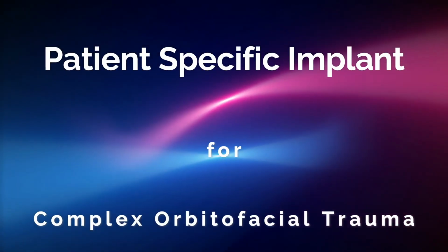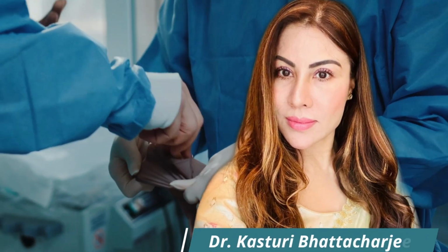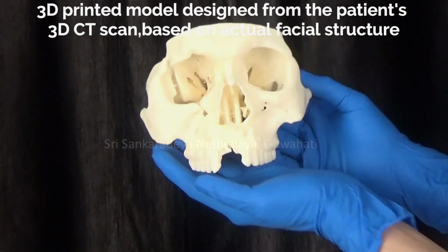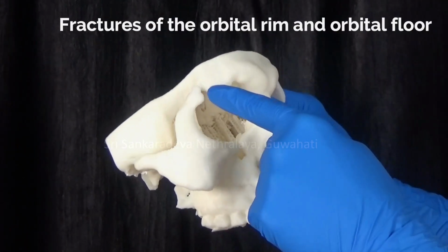Friends, let's discuss patient-specific implants for the management of complex orbitofacial trauma. When I talk about patient-specific implants, these are very customized orbital implants which are used for reconstruction of the orbit and to give a near normal look to those patients having very complex fractures involving the orbit, involving the face, and also involving the cranium.